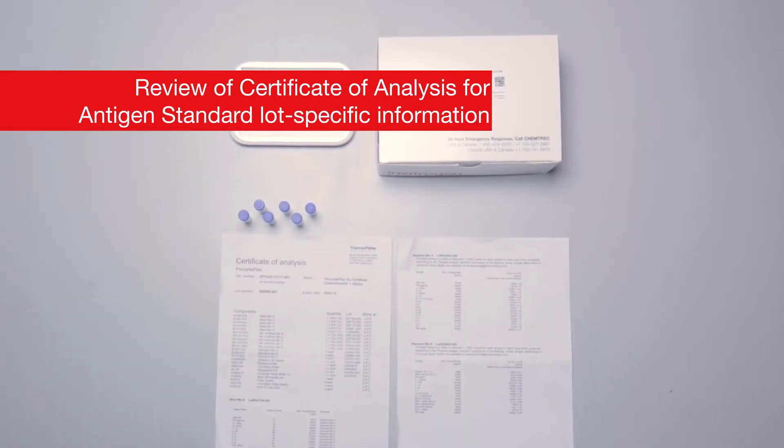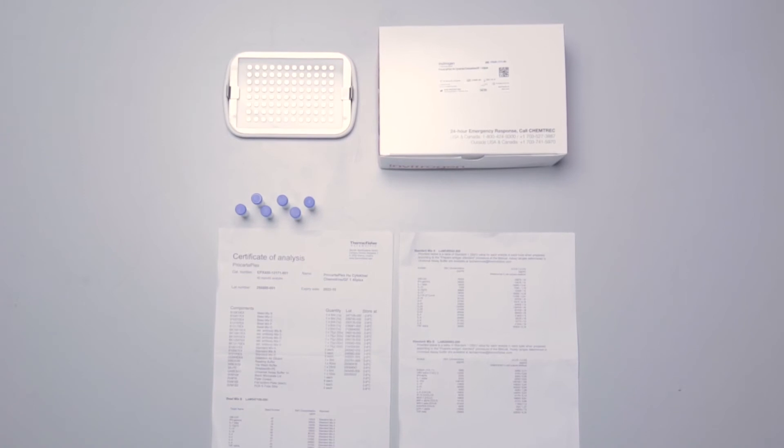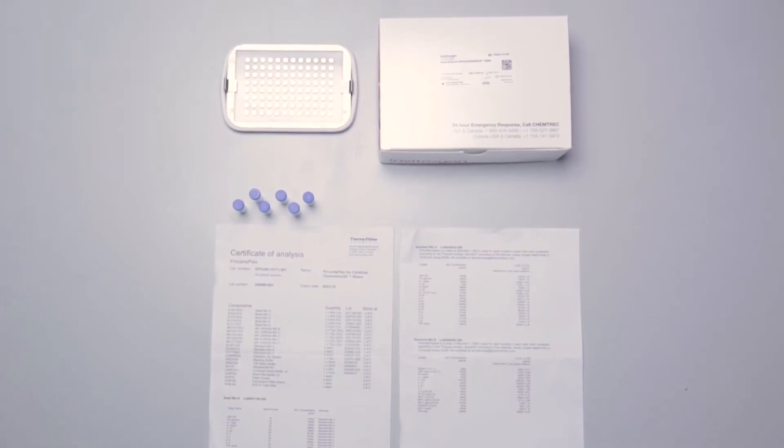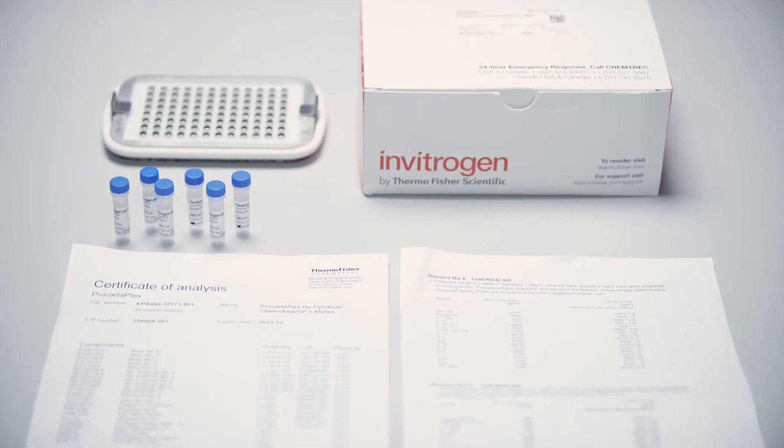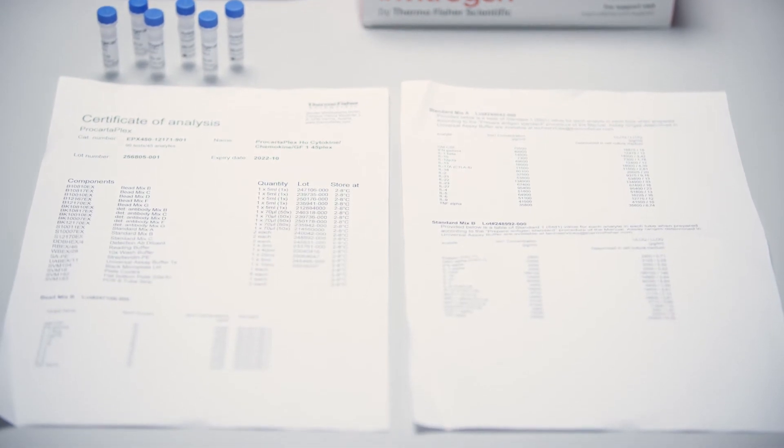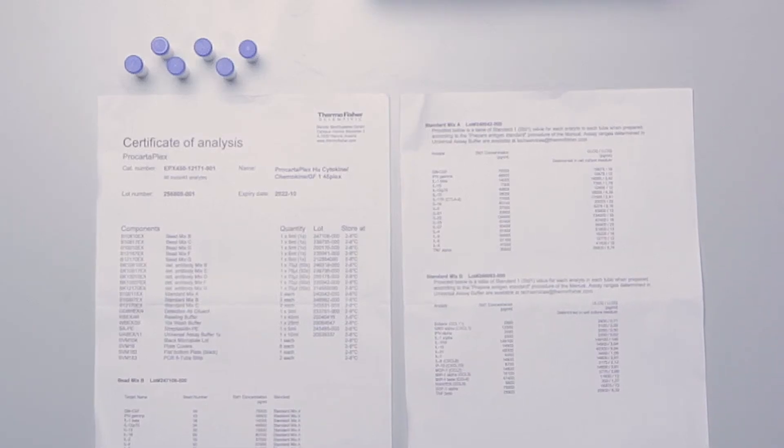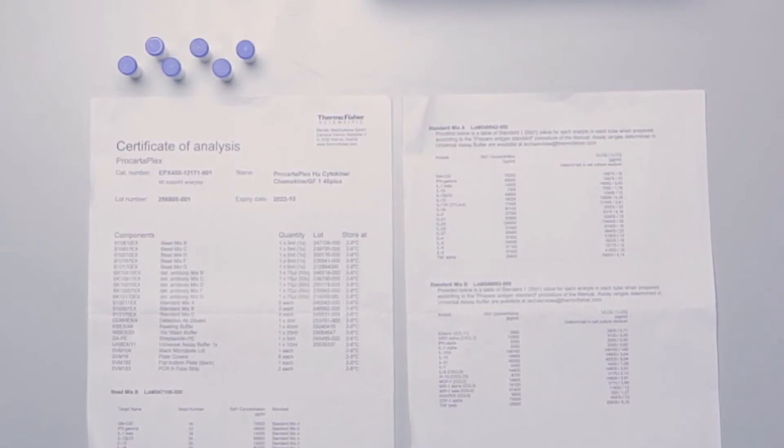Each ProCartaPlex combinable panel is shipped with two identical vials of each antigen standard to permit the user to run the assay twice if running a partial plate. Carefully review the certificate of analysis for lot specific information on the kit components and use the appropriate antigen standard. Only one vial of each antigen standard set is necessary to prepare the complete standard curve. Some combinable panels contain several different sets of antigen standards that require pooling prior to use in the assay.